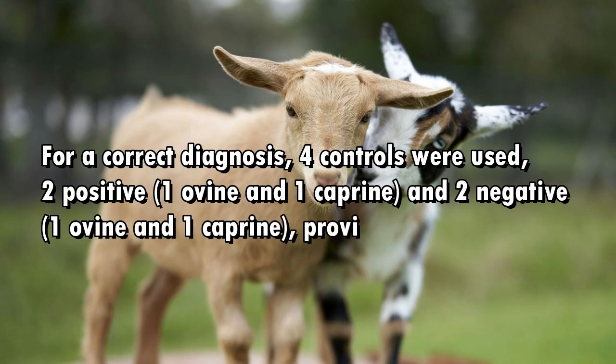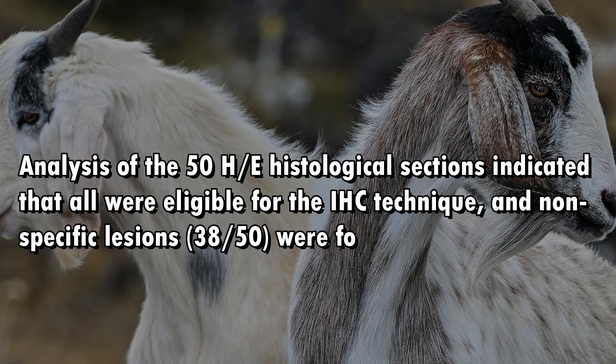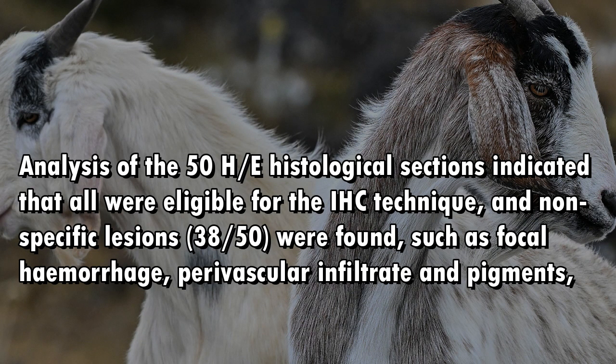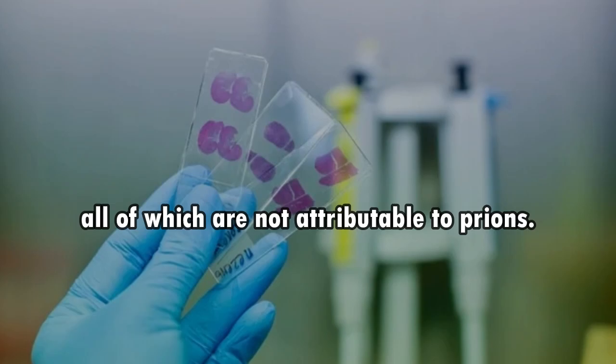For a correct diagnosis, 4 controls were used: 2 positive, 1 ovine and 1 caprine, and 2 negative, 1 ovine and 1 caprine, provided by an international reference center. Analysis of the 50 H/E histological sections indicated that all were eligible for the IHC technique, and nonspecific lesions were found in 38 of 50, such as focal hemorrhage, perivascular infiltrate, and pigments, all of which are not attributable to prion.